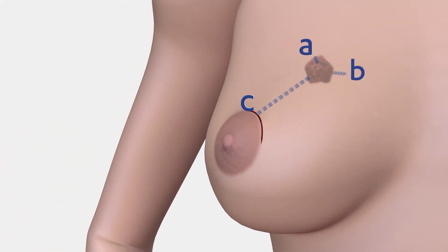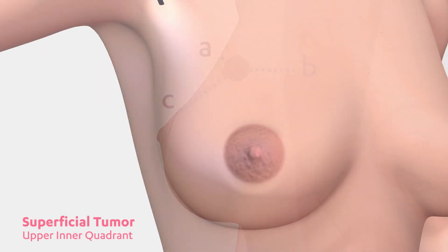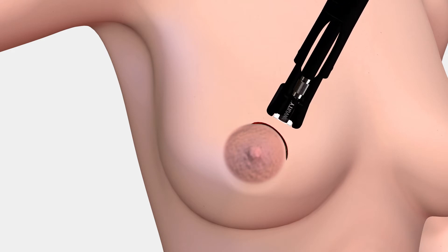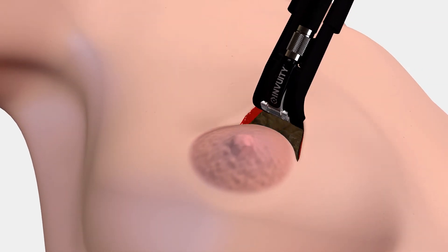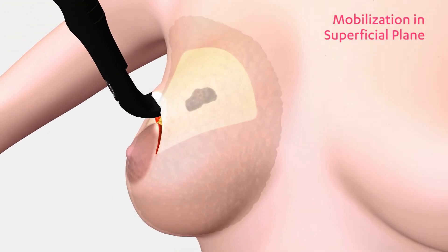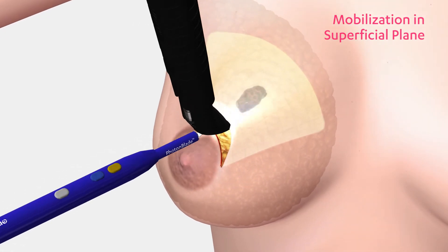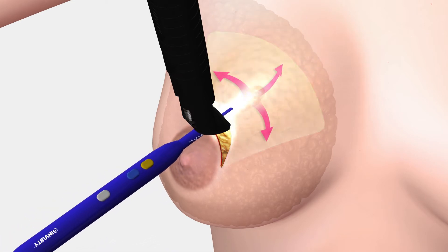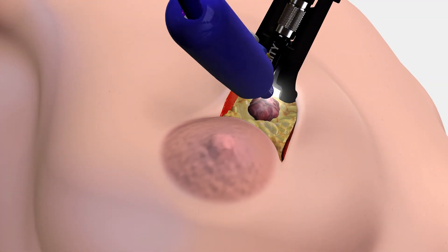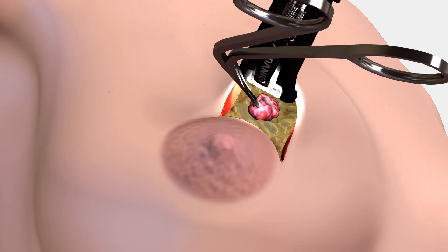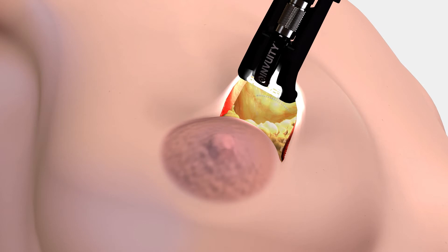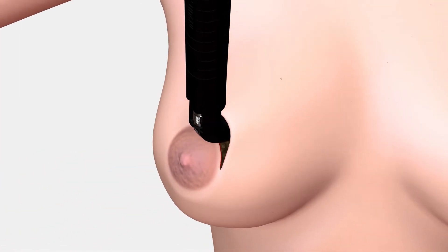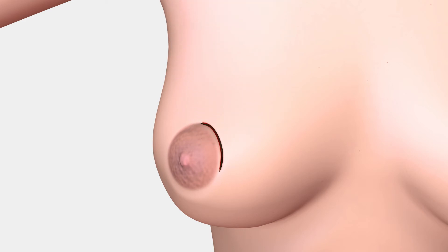A superficial tumor located in the upper inner quadrant of the breast can typically be accessed via a periareolar incision. During dissection towards the tumor, in this case in the superficial plane, extend the plane of dissection medial and lateral. This mobilization of surrounding tissue in the superficial plane allows the tissue to be re-approximated during closure. As a general principle, mobilize three to four times the width of the tumor in the medial and lateral directions, as well as past the site of the tumor. Once the tumor has been excised, prevent a defect in the breast by re-approximating the surrounding breast parenchyma. This can be done with multiple interrupted 3-0 Vicryl sutures. Once healed, periareolar incisions are difficult to see.